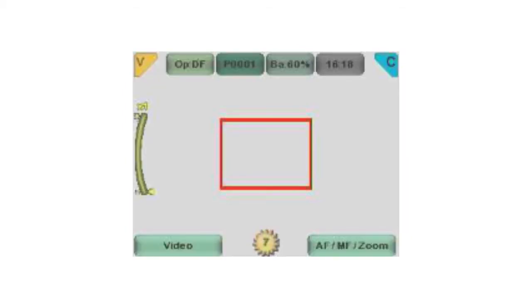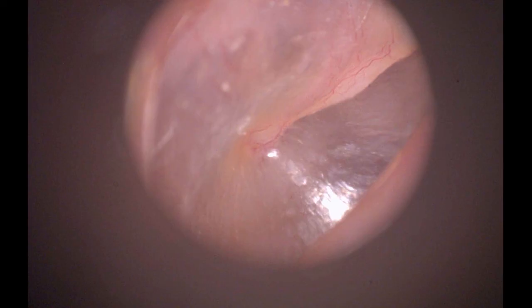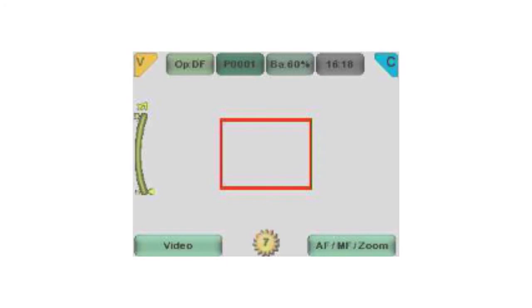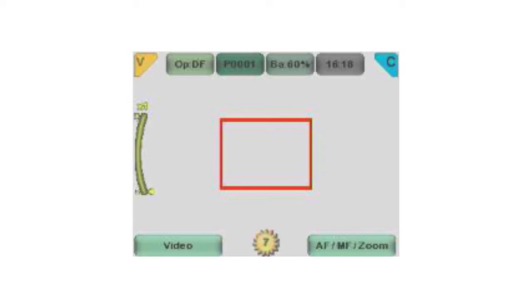Edit capture area: due to slight differences between individual specula, the image area may not be completely visible or centered when using the zoom function. Press the middle key to activate the edit capture area feature. The letter C will appear on the right top corner of the screen. Use the arrow keys to move the image area to the center.